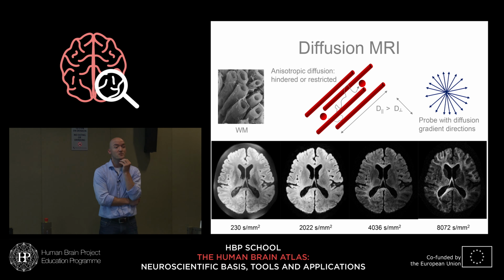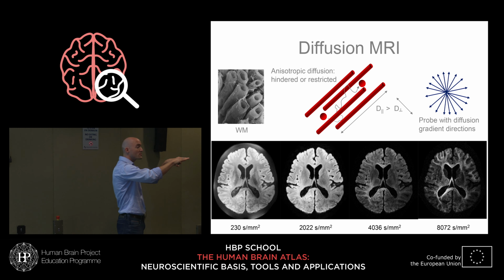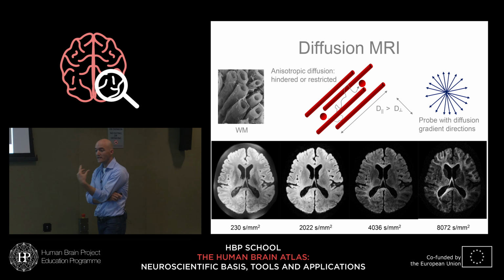The short reason for that is what I just explained, parallel and perpendicular. What actually happens with diffusion is that if the fiber direction is parallel to the current diffusion gradients, its signal gets pushed down. If the fiber is perpendicular to the diffusion gradient, the signal stays the same. So diffusion pushes signals down, and you have less signal left. And so it's already very difficult.